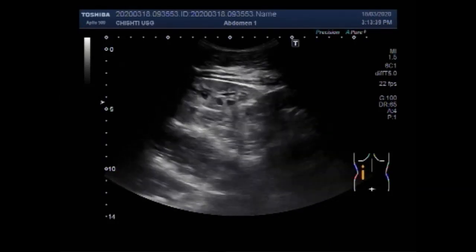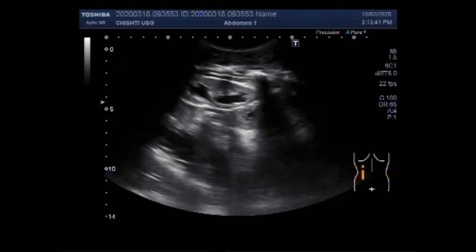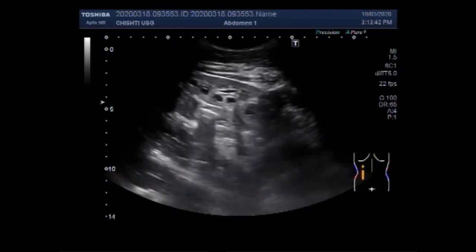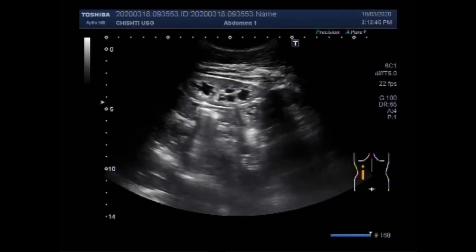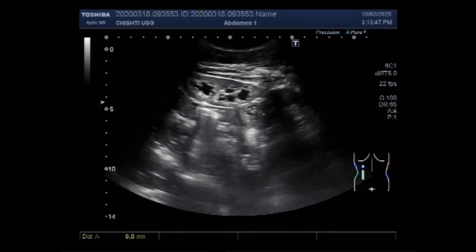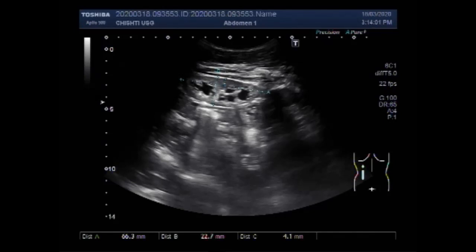The left kidney shows considerable loss of cortical thickness. Its size measures about 6.6 centimeters by 2.3 centimeters, with cortical thickness ranging from 0 to 4.1 millimeters.